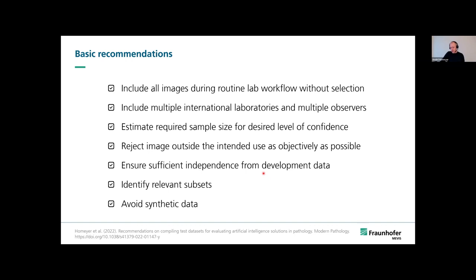Practically, obviously, that wouldn't be reasonable, because the number of images that you need really depends on the variability of your data set or your target population, and also the confidence and the precision you want to have for your performance metrics. And it's all very complicated.